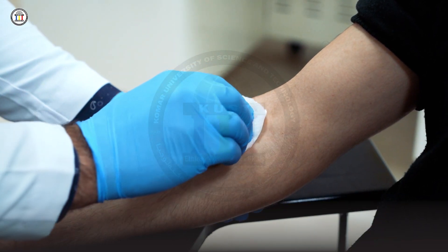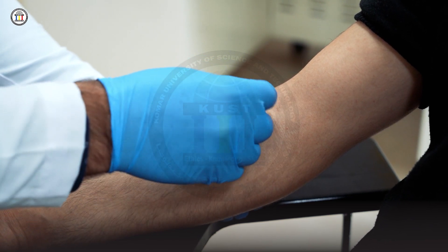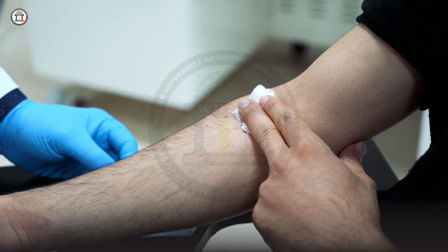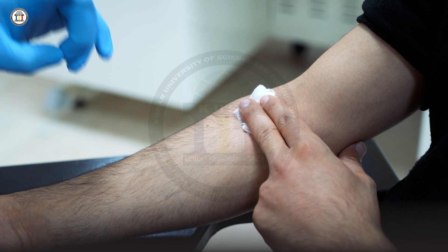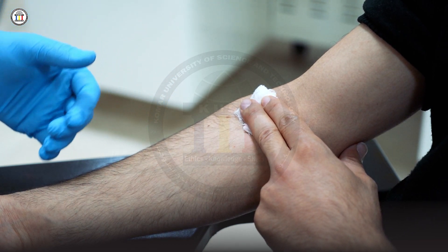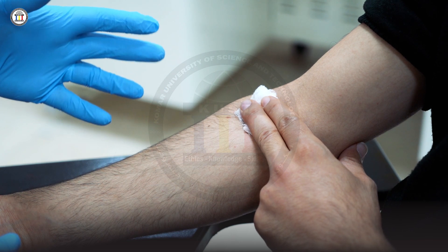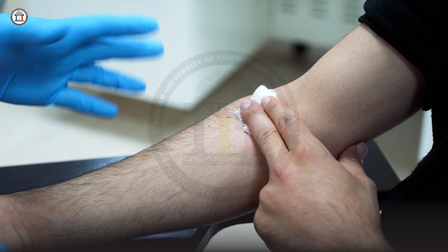After transferring the blood, check the puncture site for bleeding. If there is no bleeding, tell the patient to apply pressure for about three minutes. If you see minor bleeding, use gauze to stop the bleeding. For patients on blood thinners, stopping the bleeding may require five to ten minutes, but normally three to five minutes is sufficient.